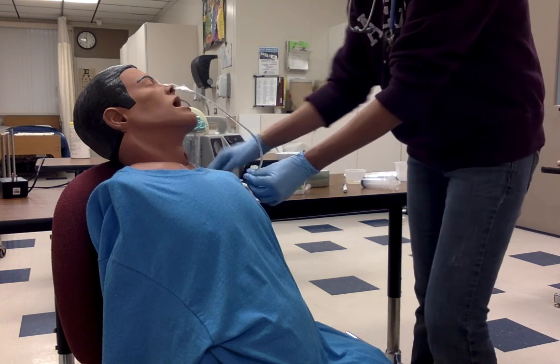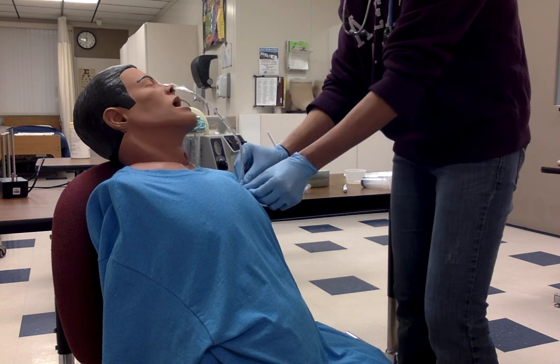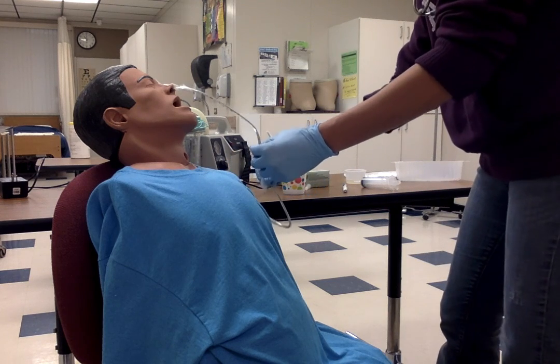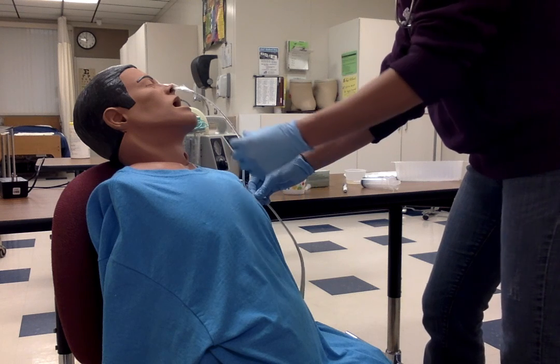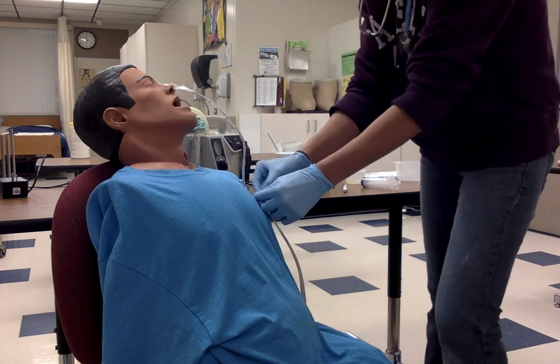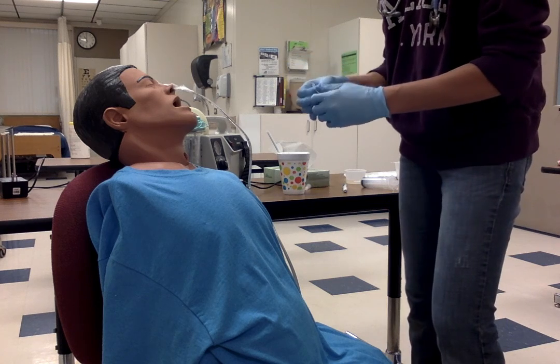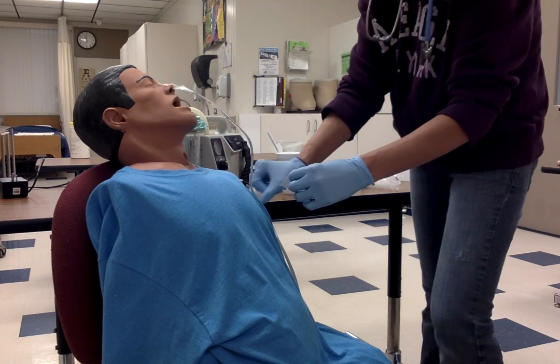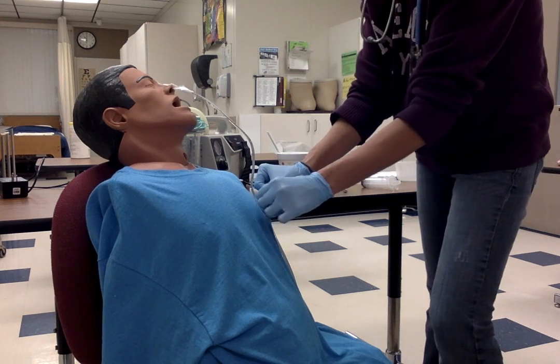So now that this is hooked up to suctioning, we have a safety pin, or in my case, I'm going to use another piece of tape. But what you want to do is make sure that there's enough give that the patient can turn their head, look up and down without causing too much tension. Now, you don't want coils of it, but just so that they have enough room to move their head around without pulling it out. So you would never pin to the tube. You always want to put a piece of tape on, and then you would pin to the piece of tape. So I'm going to go ahead and pin that down.